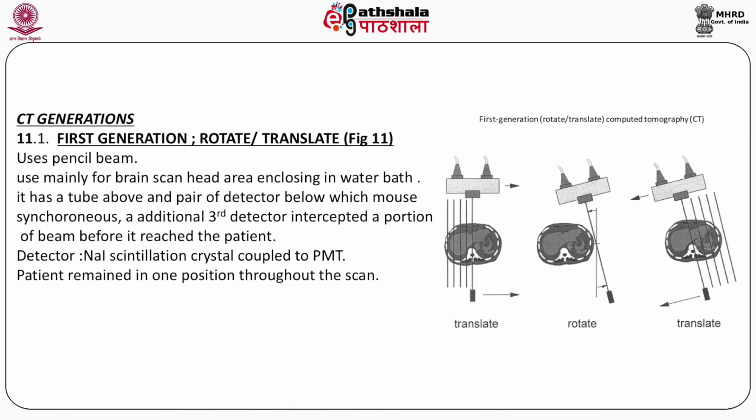In this case you can see here the first generation CT scanner, a pencil beam is used, and first the X-ray beam is translated from a particular angle. The X-ray beam is translated.